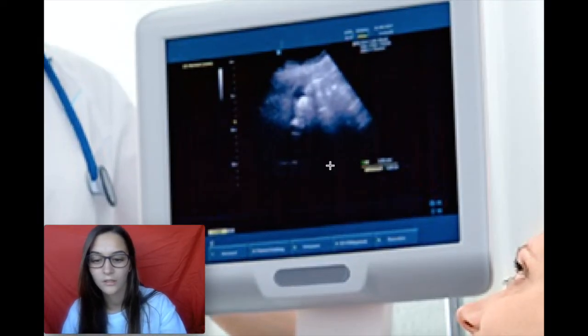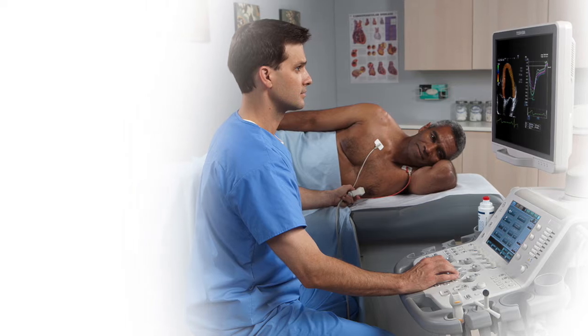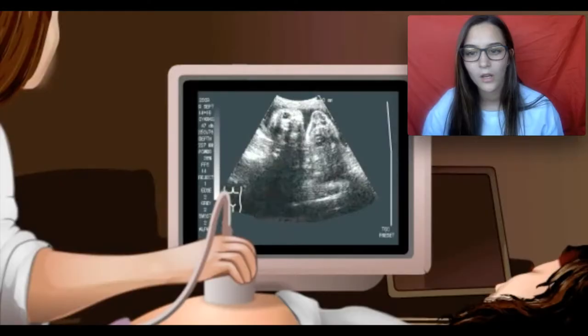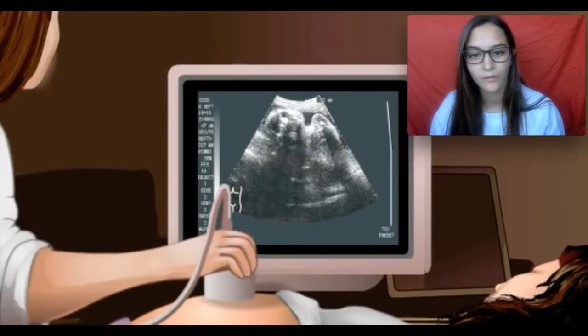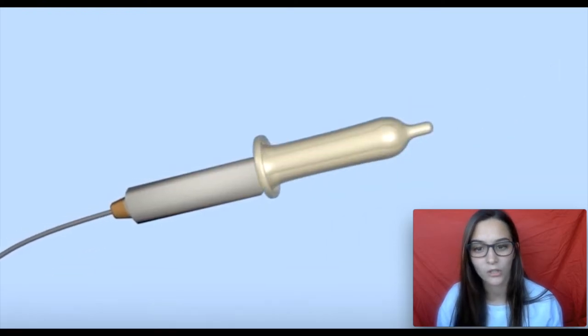display monitor. Ultrasound procedures will always include gel being applied to the part of the body that is being examined, and this is because we need to remove the air pockets between the skin and the transducer, as waves do not pass efficiently through air and the image will be deformed. The sonographer will sweep the transducer back and forth on the part of the body with applied pressure. Probes are used the same way, but gel is applied over the probe prior to insertion. Obstetricians and radiologists are often able to review images in real time to provide the patient with a diagnosis, but otherwise the patient will receive their results later.